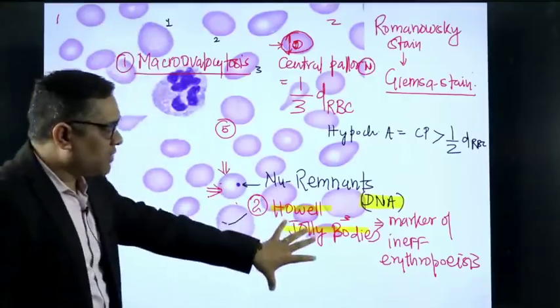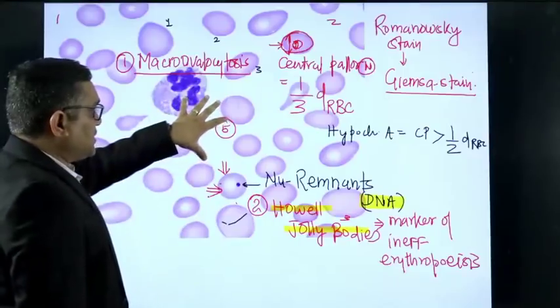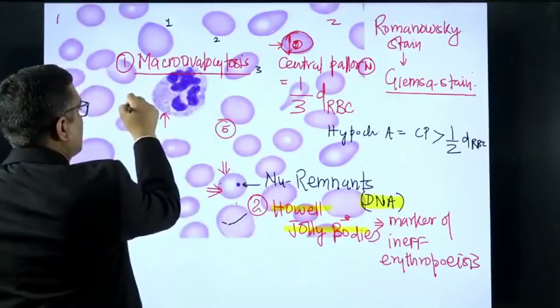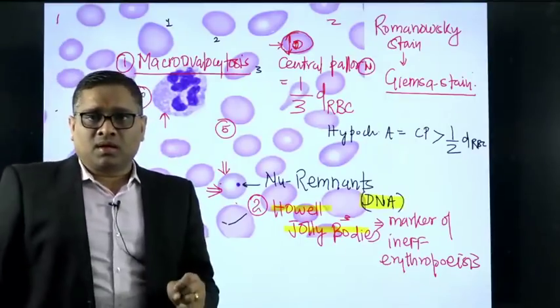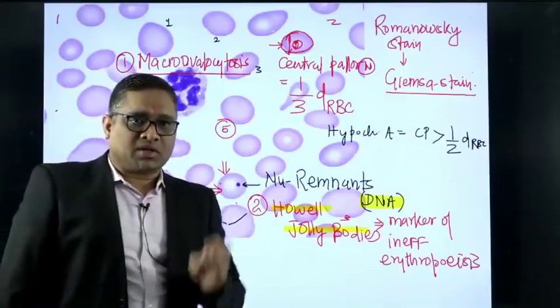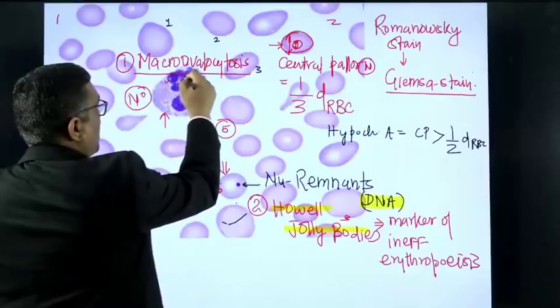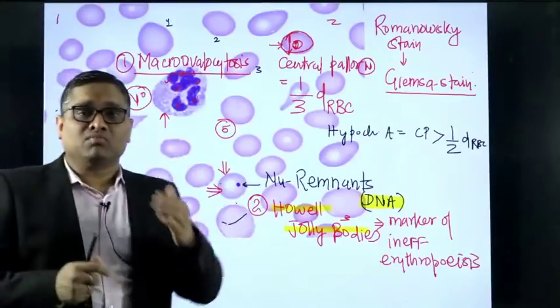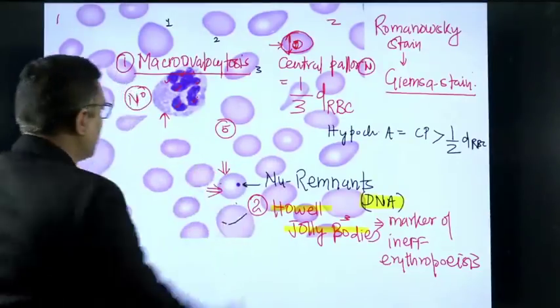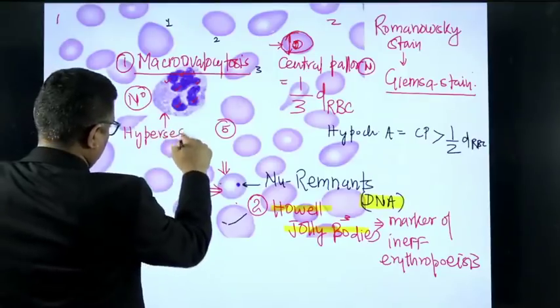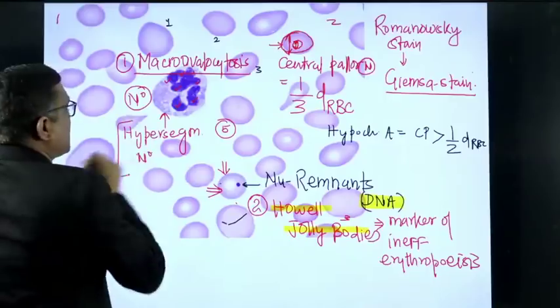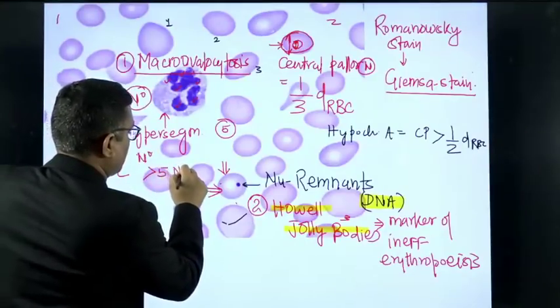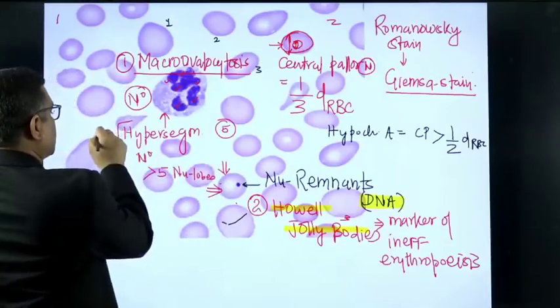Following the rule of 5, we also notice one more thing in the center: a neutrophil. In any normal neutrophil, there are 3 to 5 nuclear lobes. But in this neutrophil, we are observing 1, 2, 3, 4, 5, 6, 7 — there are 7 nuclear lobes. A neutrophil with more than 5 lobes is called a hypersegmented neutrophil. This is the third important finding.